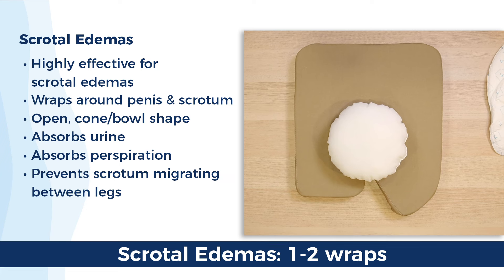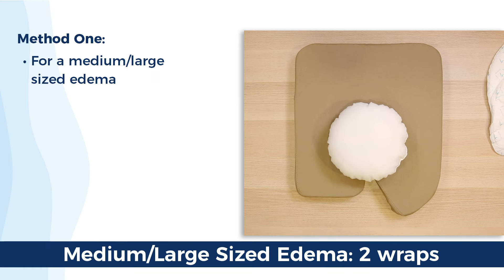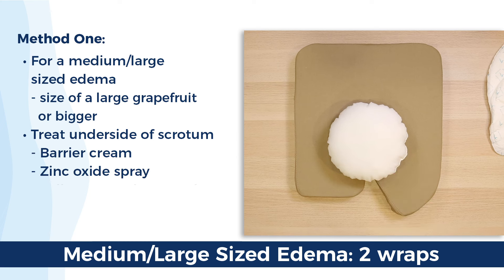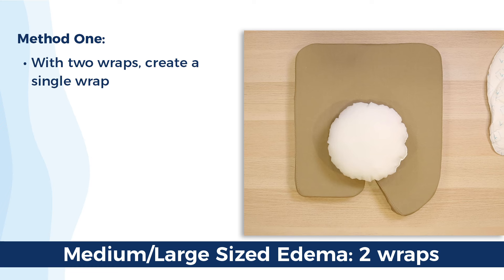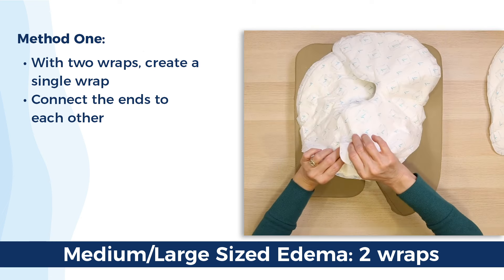It also prevents the scrotum from migrating down in between the legs. Let's walk through our two methods. We'll start with a medium or large edema, about the size of a large grapefruit. Make sure you treat the underside of the scrotum with any type of barrier cream or zinc spray per your protocol for protecting that sensitive skin from urine. We're going to take two QuickChange wraps and create one large wrap by connecting the two ends using the velcro tabs.